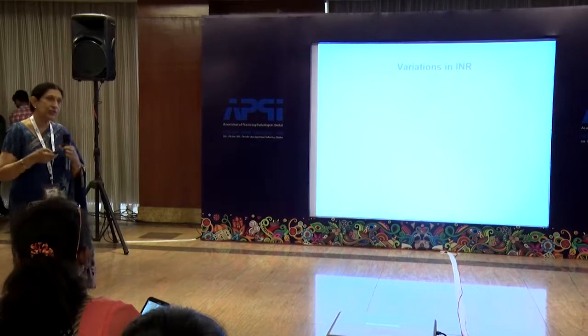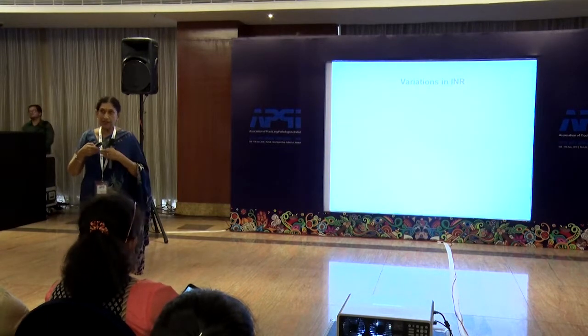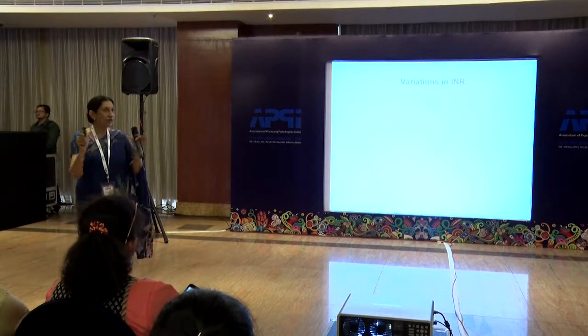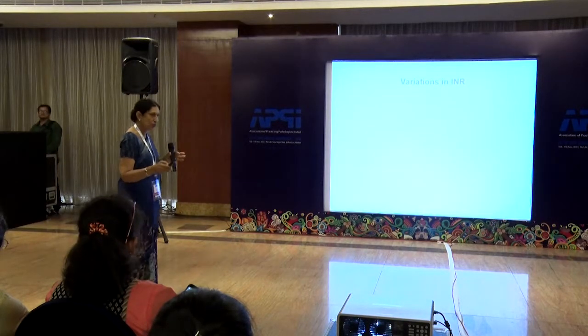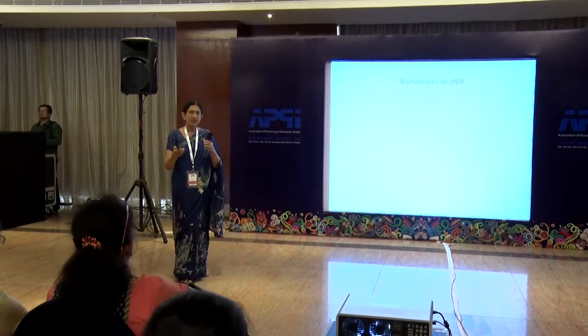Their sensitivity to factors is different. So how can you compare my thromboplastin, which is rabbit brain thromboplastin, to human placenta or a recombinant? You can't compare. And in spite of all the efforts of the International Society, it has not been solved till today. INR is a big challenge.